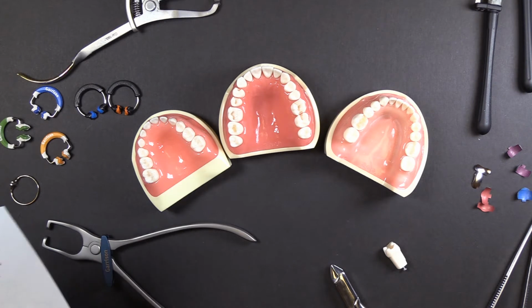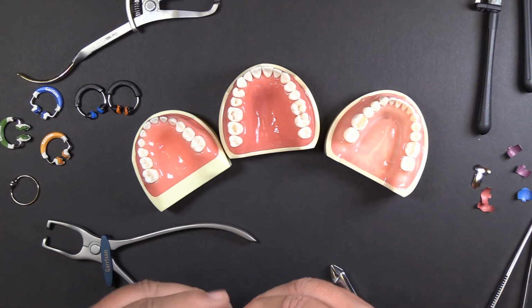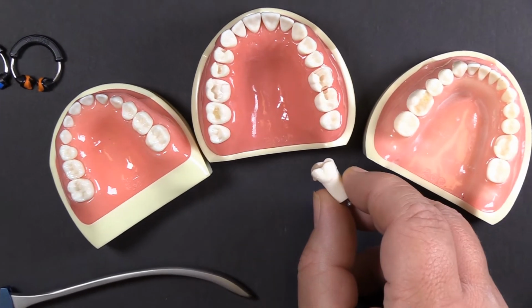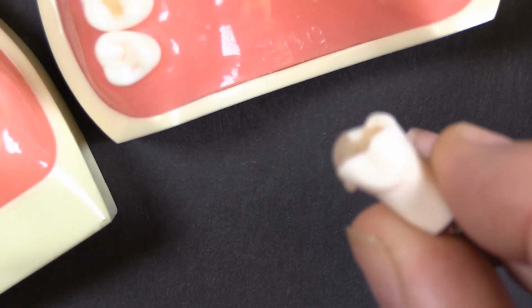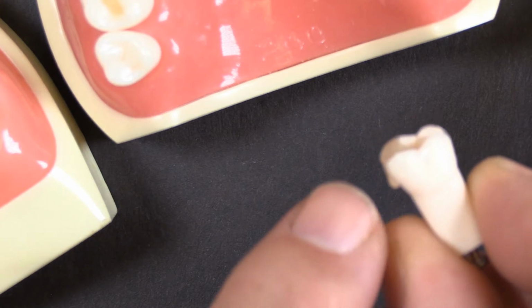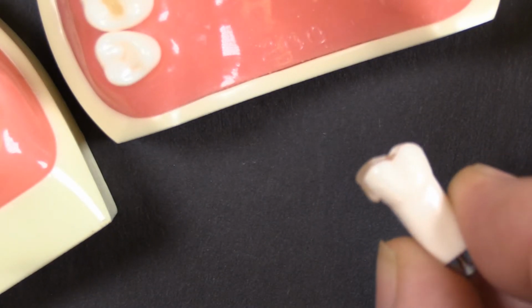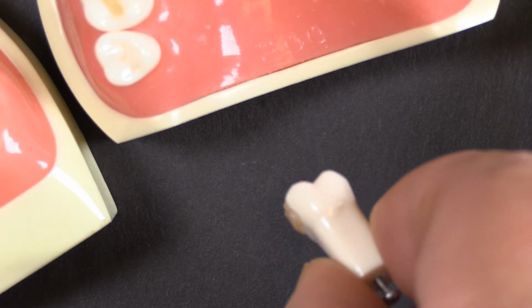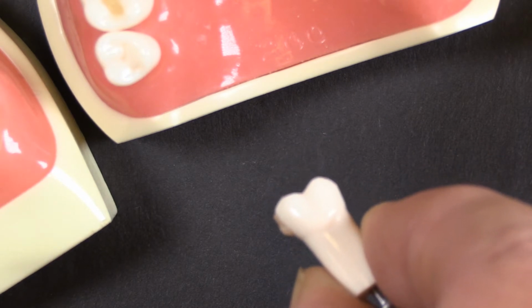I have a really good example here for you. This little tooth has both a gingival overhang, and then, as you see here at the buccal line angle, it has a big buccal overhang as well, and you can see underneath here how it has such a significant overhang. And I'll tell you what happened to cause that.